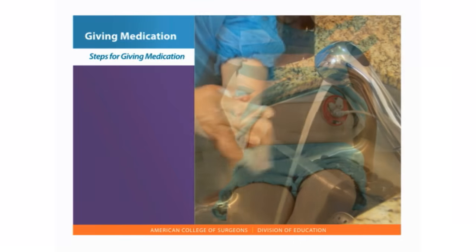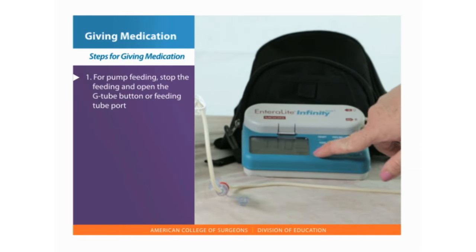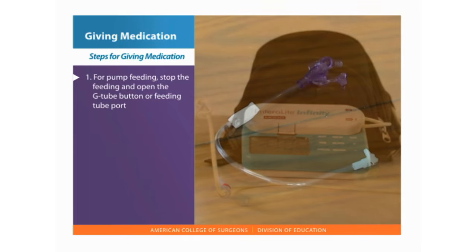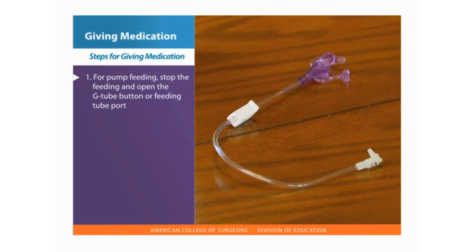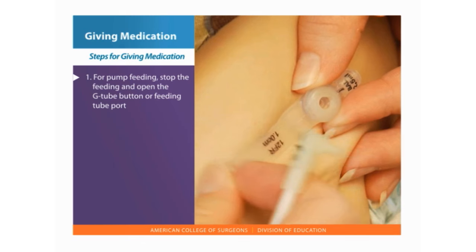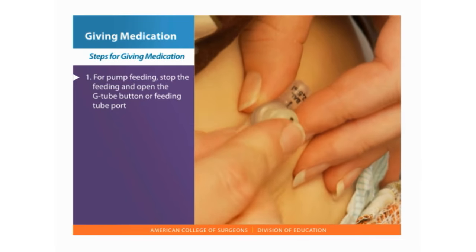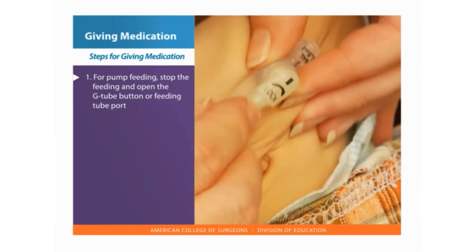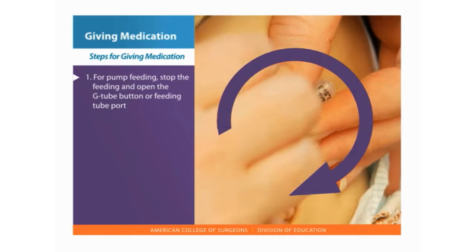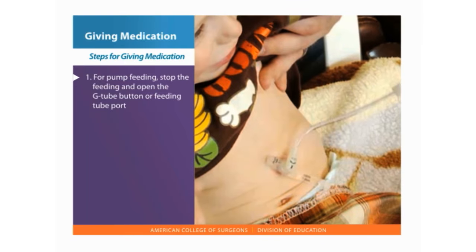Wash your hands. Position upright. 1. For pump feeding, stop the feeding and open the G-tube button or feeding tube port. If needed, attach the feeding extension set to the G button. Hold the button firmly and open the safety plug or cap. Line up the black marks on the end of the extension set with the marks on the feeding cap. Insert the feeding set. Turn clockwise to lock, about a 3/4 turn. Check to make sure the feeding set is secure.